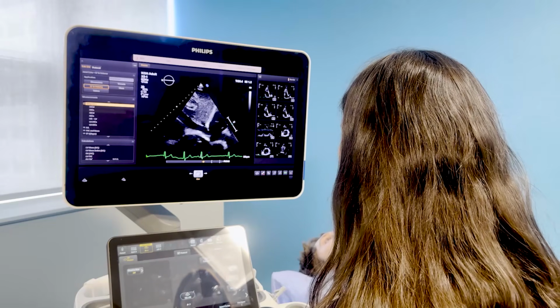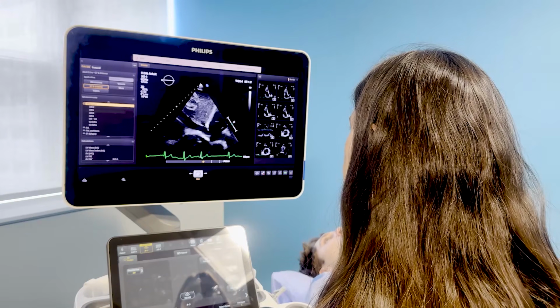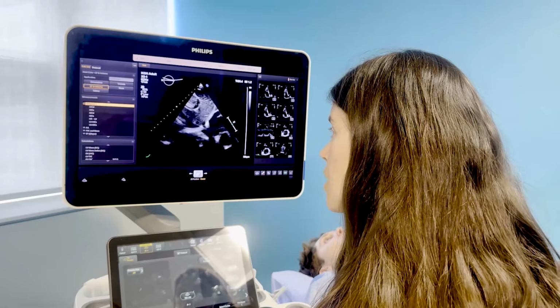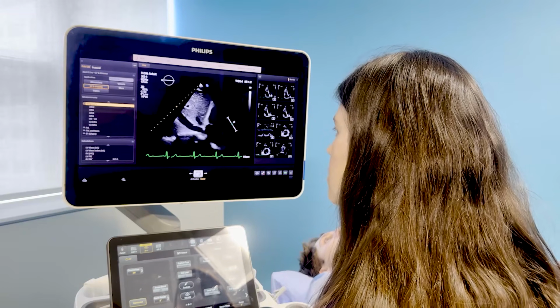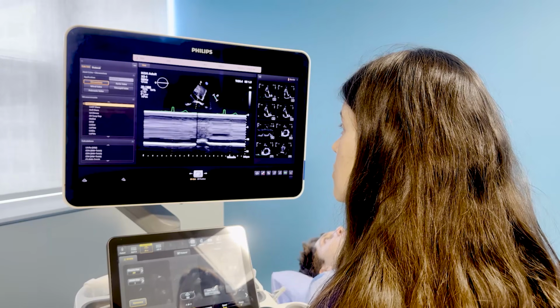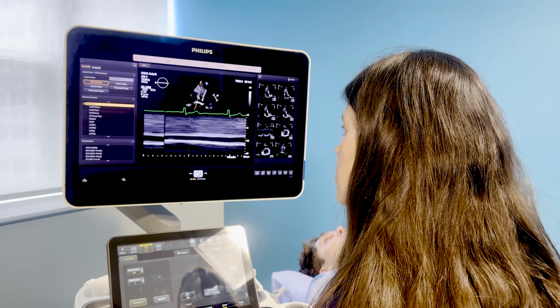Okay, great. And would you do this in M mode or 2D? I believe the guidelines and best practice is to do it in 2D. Our lab, currently our package is set up to do the measurement using M mode. I think maybe moving forward 2D might be better, but you can do it using M mode as well. You just want to make sure your cursor is really nice and well aligned. Adjust my angle a little bit. So I would do it from here then.